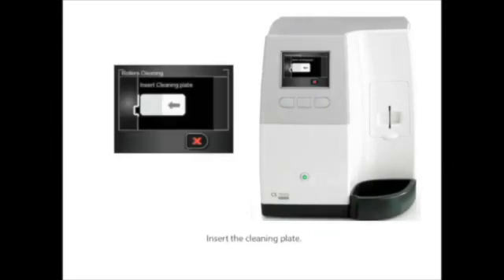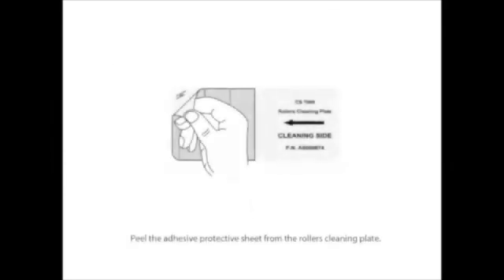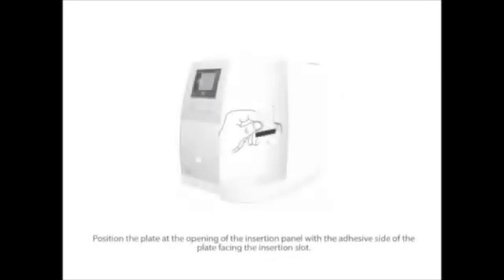The LCD screen prompts you to insert the cleaning plate. Peel the adhesive protective sheet from the roller cleaning plate. Position the plate at the opening of the insertion panel with the adhesive side facing the insertion slot. The black stripe on the plate should be located along the bottom, facing away from the LCD screen.